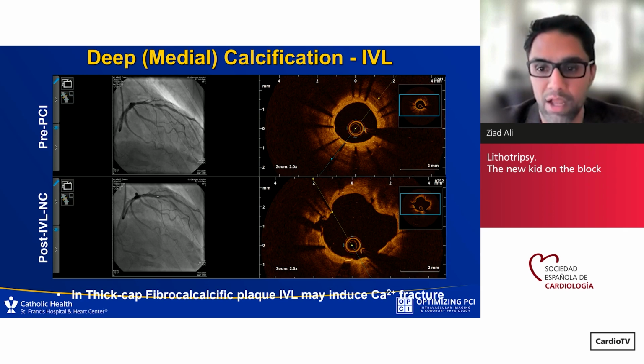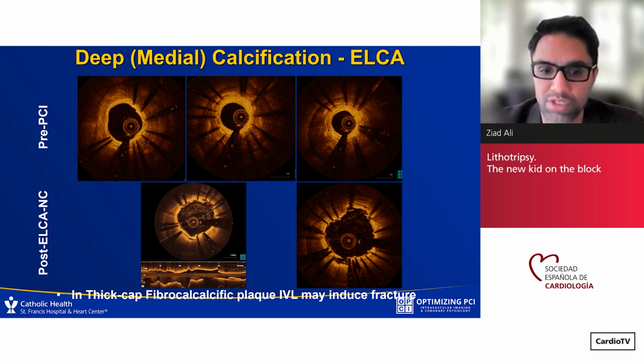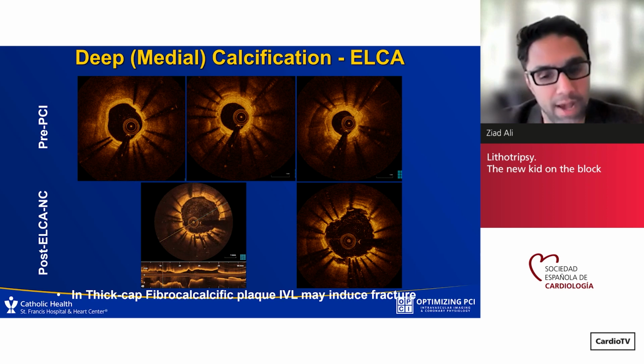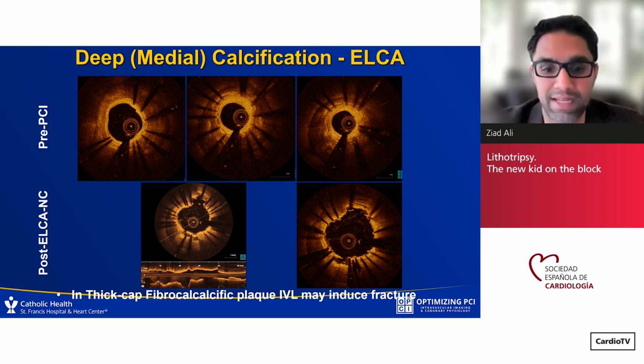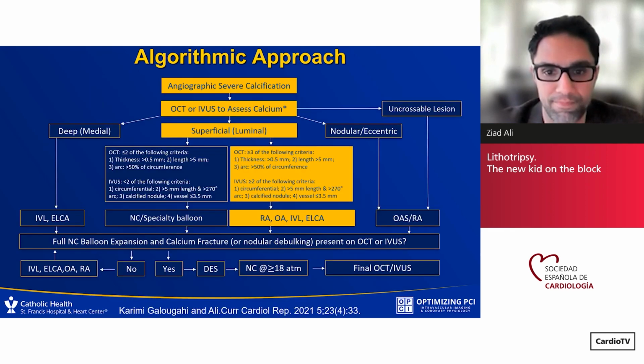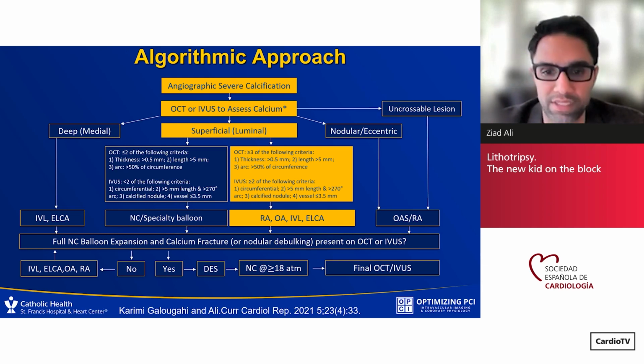On the contrary, when there is neointima on top, with IVL the balloon squeezes the pillow and fractures the calcium. We've removed the impedance by squeezing it with the balloon and delivered the energy directly into this thick calcified plate, leading to multiple fractures. In fairness, laser is also able to do this using the same mechanism, which is the creation of cavitation bubbles. But unlike laser, which is focused energy, the unfocused energy of IVL makes it reproducible and extremely safe.